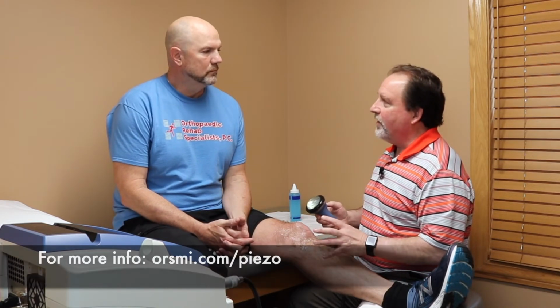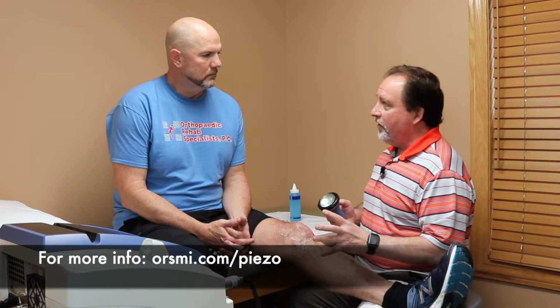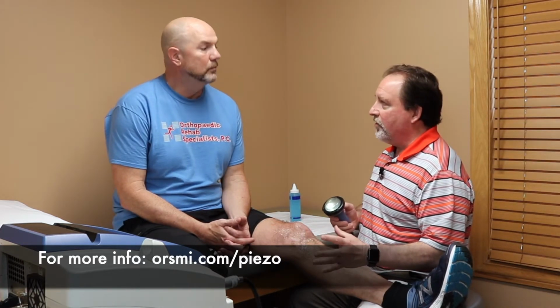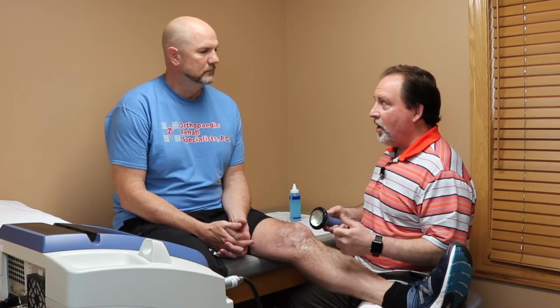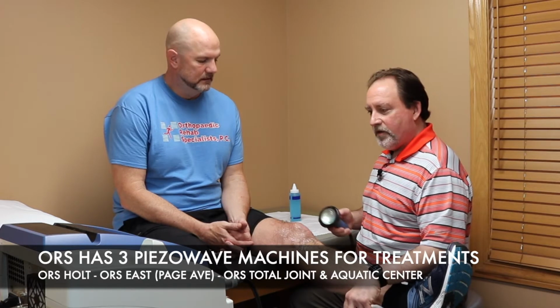The person who was very nervous about the initial treatment or had some discomfort, once they feel that relief, they're anxious to get back next week and give it another shot. And then it's more like, okay, move it over a little bit, turn up a little bit. I can take a little more because the results are so good. They want to come back. So day 3 and day 4 following an initial treatment? Initial treatment.